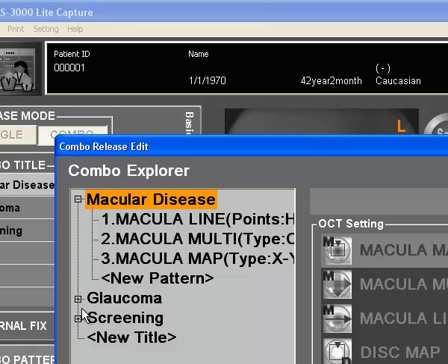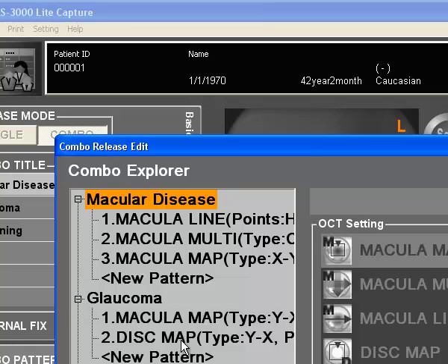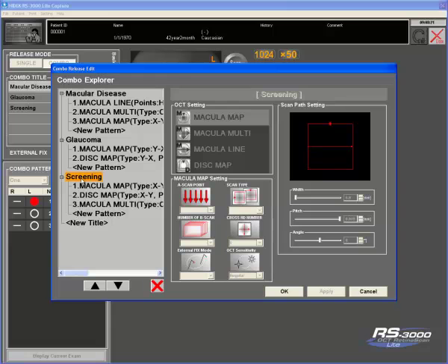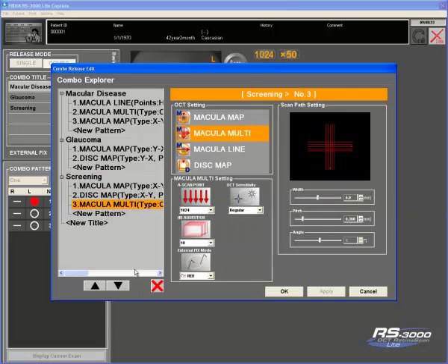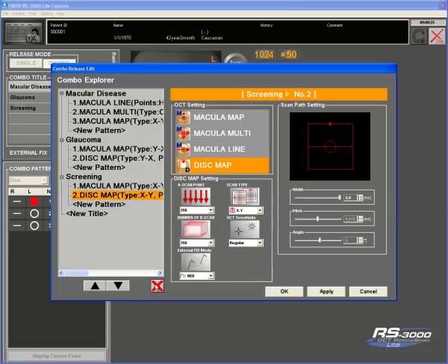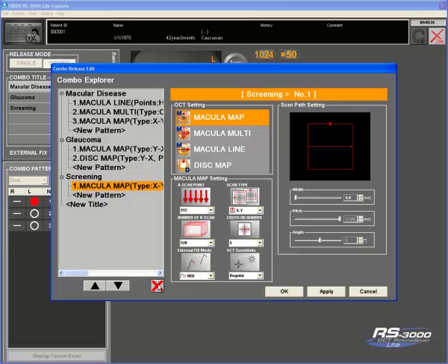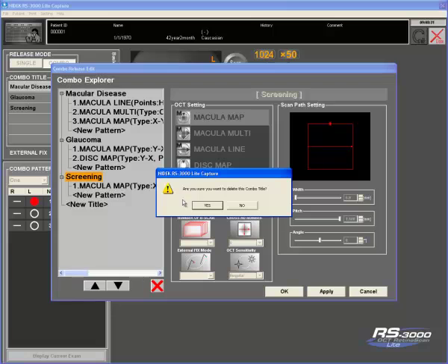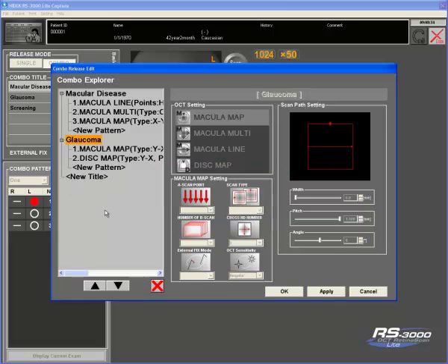These are your different combinations that you have set up. If you wish to delete a particular map, simply click the map, hit the red button and that will delete it out. If you wish to delete an entire section, simply click the title, delete that, it will ask are you sure you want to delete this, click yes, and it is gone.